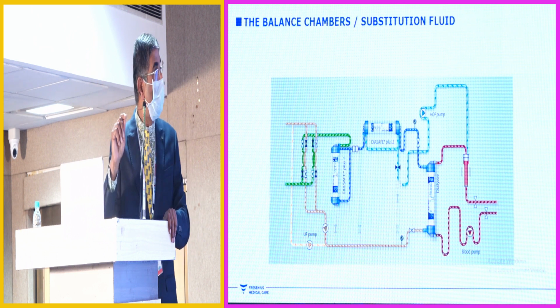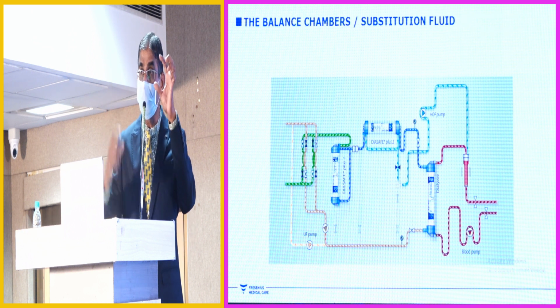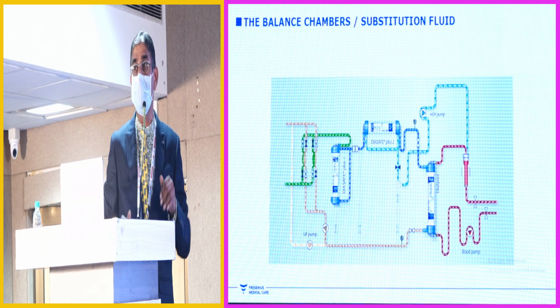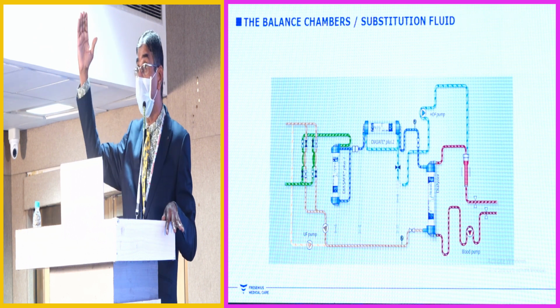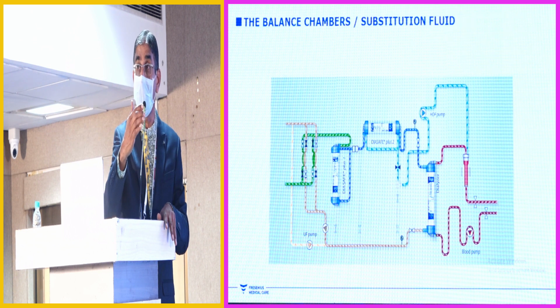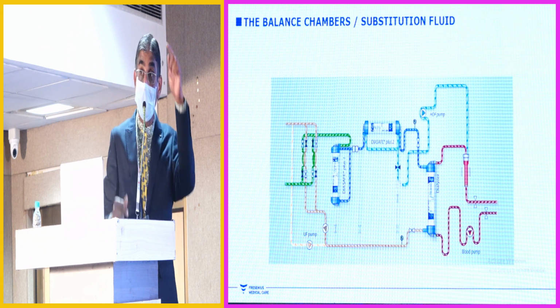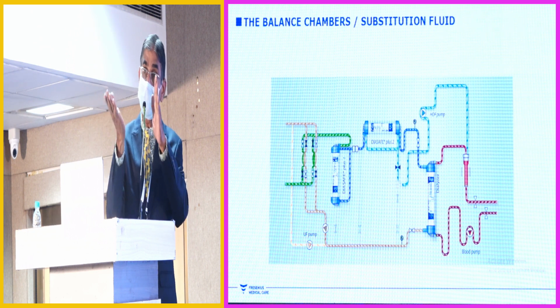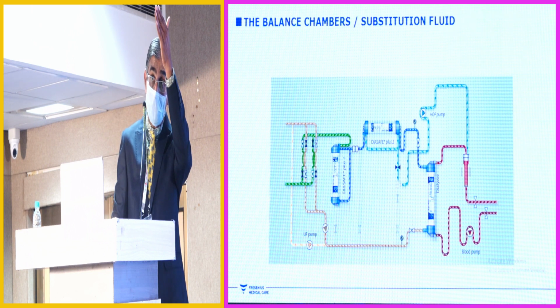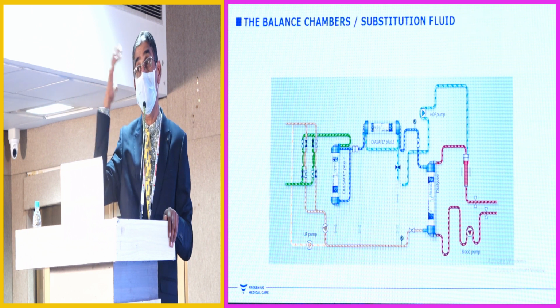Three more slides. So Sir was talking about water coming in, heater is there, thermostat like our brain, thermistor, and you have a heat exchanger assembly before the heater. So when the spent fluid, which has already been heated, is coming out of the dialyzer, it's already at a certain temperature, say 36.5. So the incoming water is cooler. This will transfer the heat in the heat exchanger assembly to the other side. So the incoming water is already heated. When it goes and touches the heater, the thermostat is like our hypothalamus.